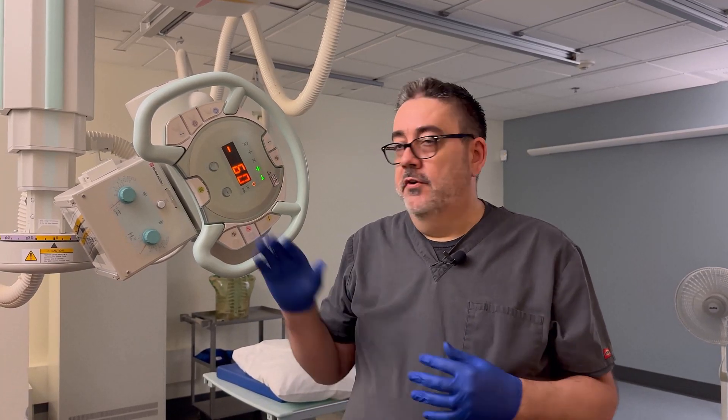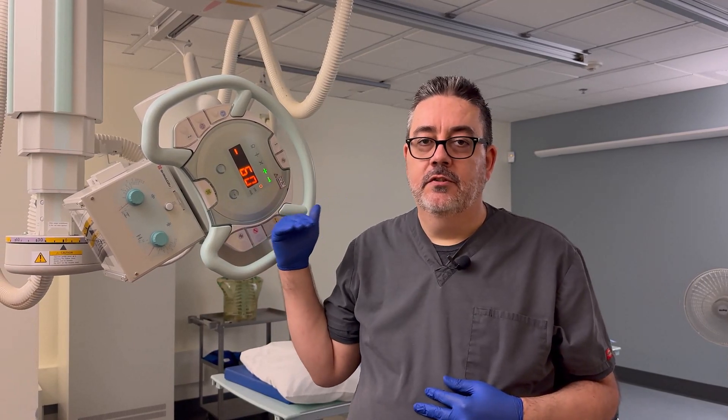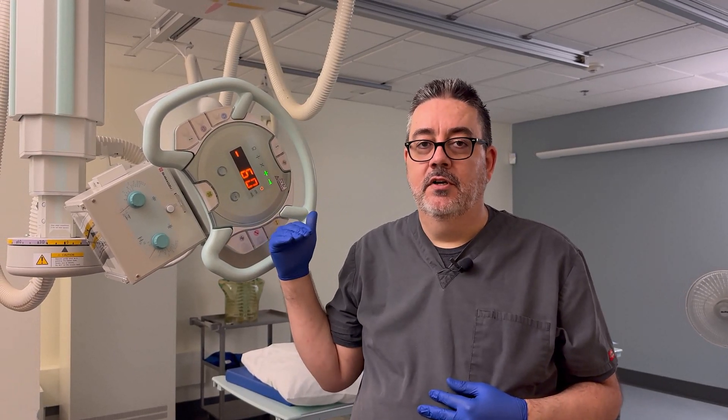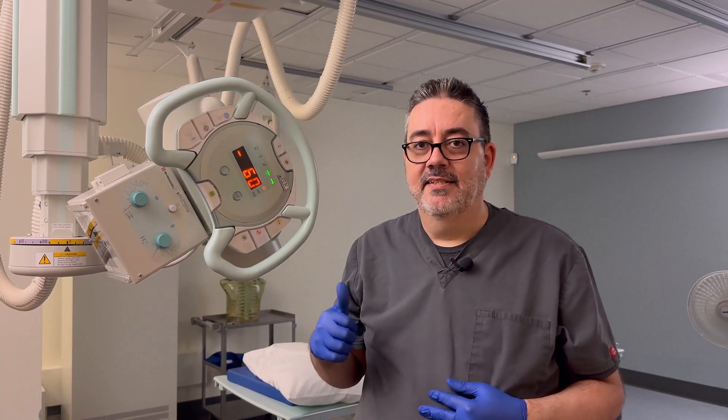For this projection of the mandible, we'll be doing the AP Towns view. This is going to differ slightly from the view that you do for the TMJs in that we are going to include the entire mandible. Much like the Towns view for the skull, we'll do a 30-degree caudal angle. We place the patient's OML perpendicular to the image receptor, but our central ray is going to be about an inch distal to the nasion.